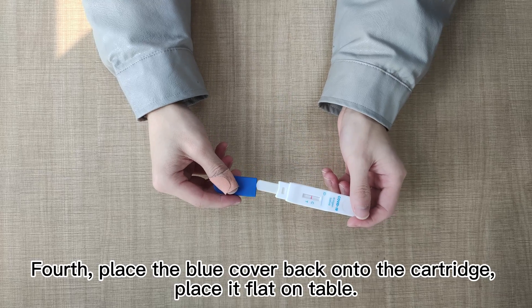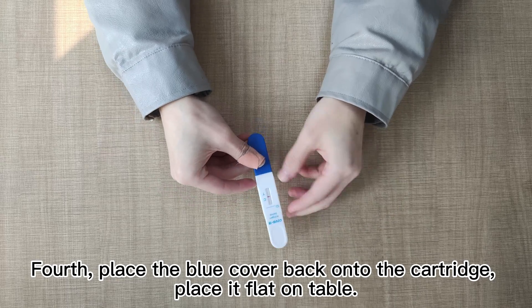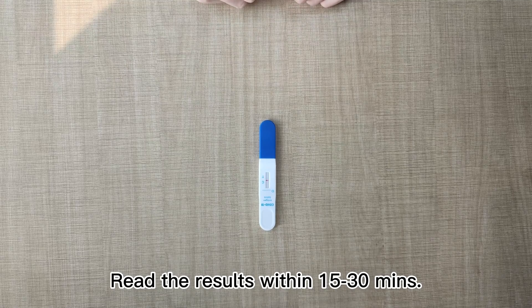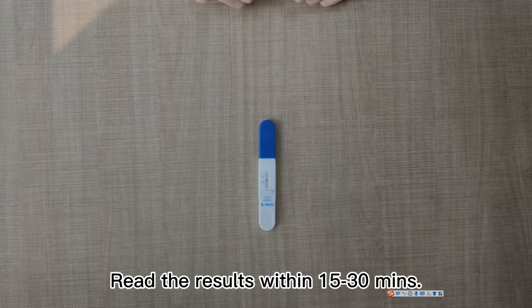Fourth, place the blue cover back onto the cartridge and place it flat on the table. Read the results within 15 to 30 minutes.